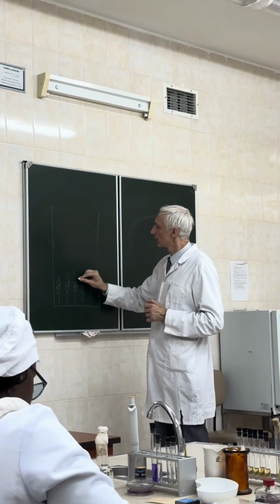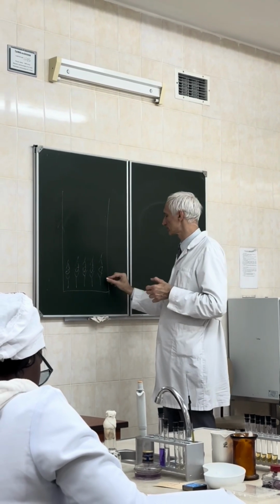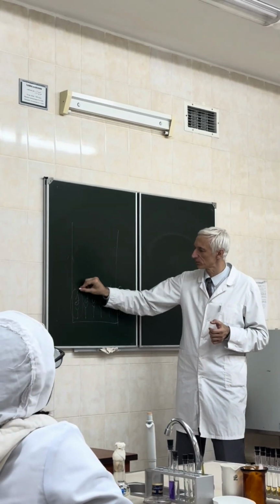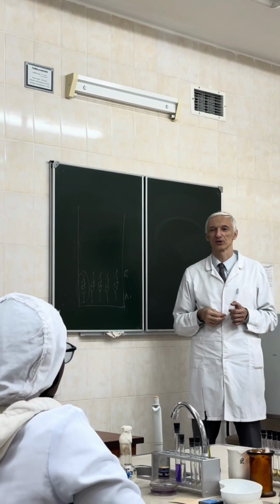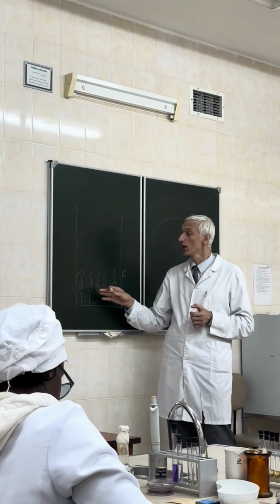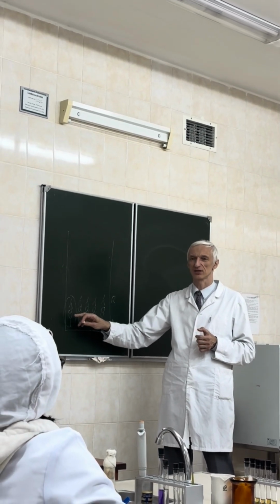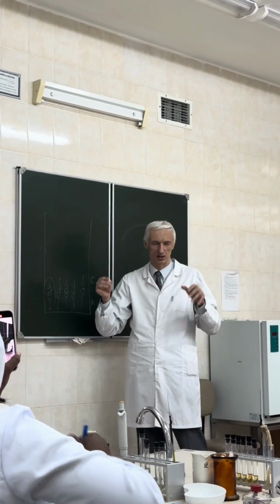Usually we use antibodies of another species. Let's imagine polyclonal. This is murine, for example. This will be rabbit antibody. By the way, who remembers the name of this complex antibody? Sandwich immunoassay. Yeah, this is typical sandwich immunoassay. So I think everyone understands that if it is possible to create a sandwich assay, the antigen should be large enough. Its area should be enough to attach both antibodies to it. Now, virus is a really large particle.